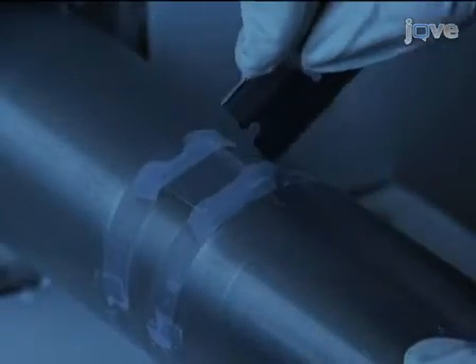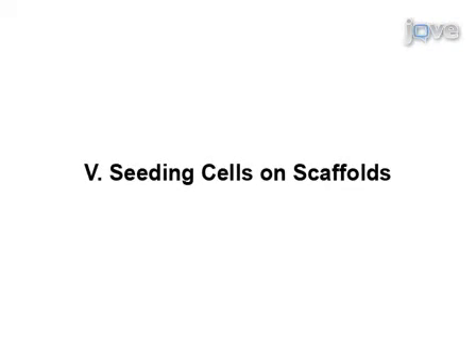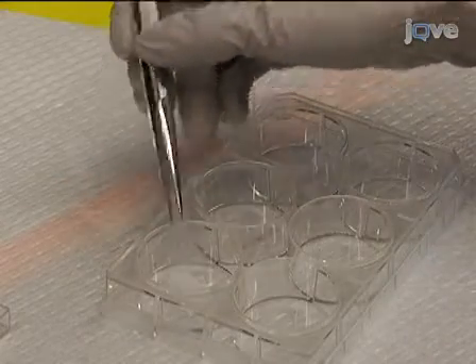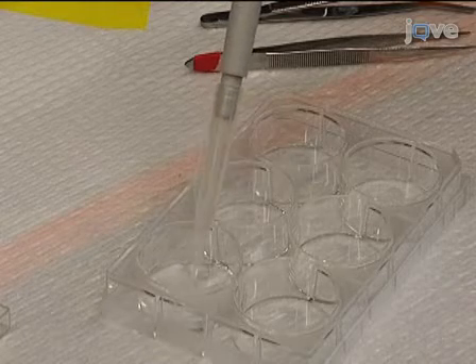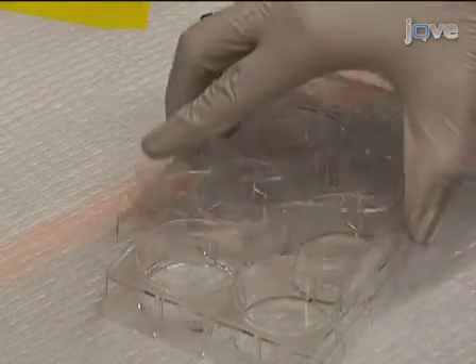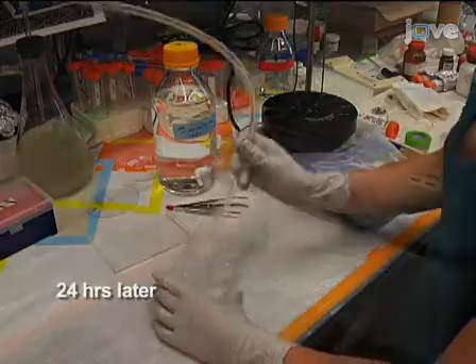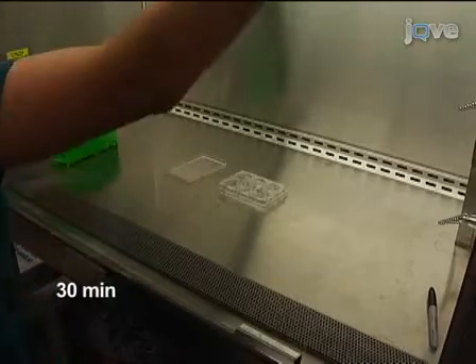Carefully remove the coverslips and tape using a razor blade. Fibers can be visualized on a fluorescent microscope equipped with filters for rhodamine and DAPI. Place each coverslip with electrospun polymer attached into an individual well of a 6-well plate. Incubate the scaffolds in 2 milliliters of PBS overnight to ensure complete removal of solvent and contaminants. After 24 hours, use vacuum to aspirate the PBS from the well. Place scaffolds under a germicidal UV lamp in a laminar flow hood for 30 minutes for sterilization.